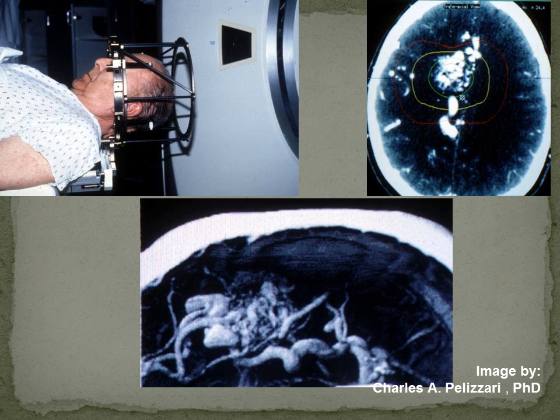Okay. When CT angiography became possible, and even in the early days, it was a little more difficult. We had to wait for about the 3rd generation CT scanners to be able to do these scans fast enough. We were able to actually start to visualize the nidus and get a true 3-dimensional view of it. And this has really helped us in being able to plan conformally. And there's one of our, I think this is our 2nd patient that actually went through the scan.